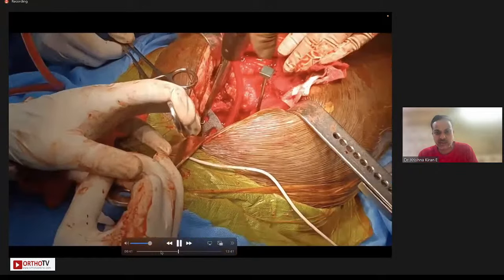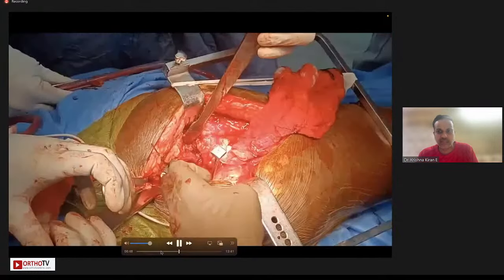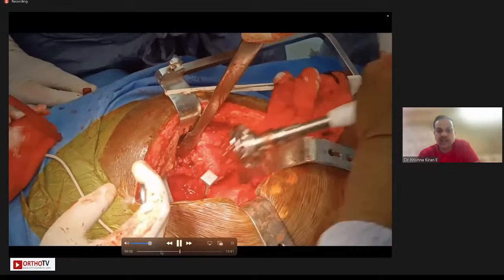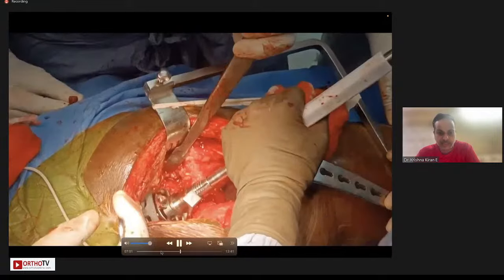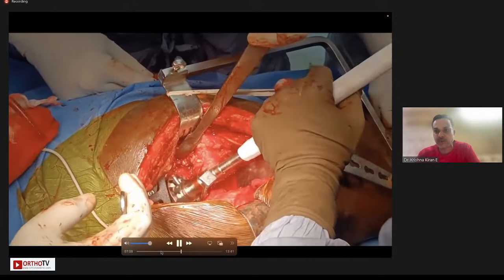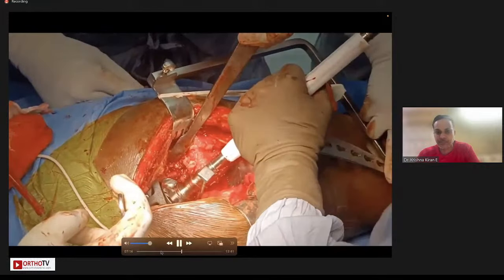So here you see we are securing the augment with two screws and now we are converting this into a contained acetabulum. So what was an uncontained defect now became a contained defect. And now I'm again fine-tuning the size of the socket. I'm reaming between the augment and the remaining host bone. But I already know what is the AP capture point so that I'm not undersizing this cup. So the first step of doing a reverse reaming to identify the AP capture point where your reamer disengages becomes a crucial part of the surgical technique to avoid premature failure.